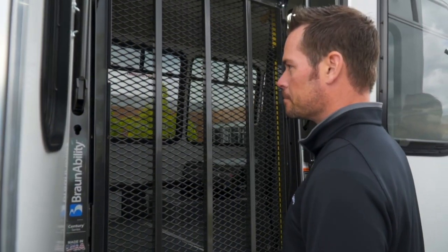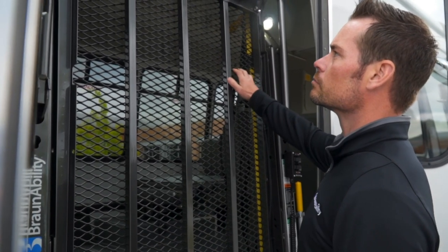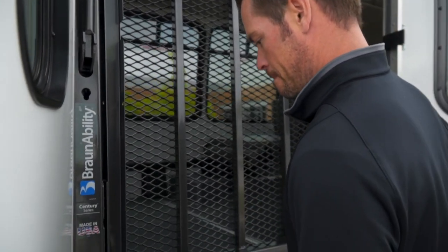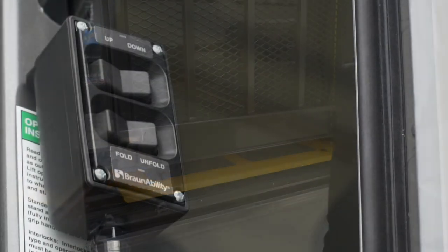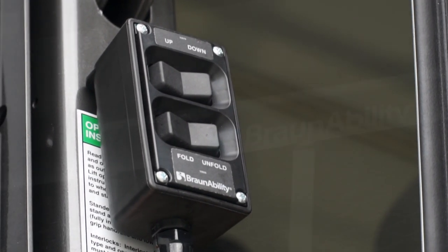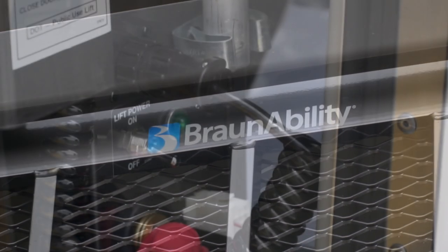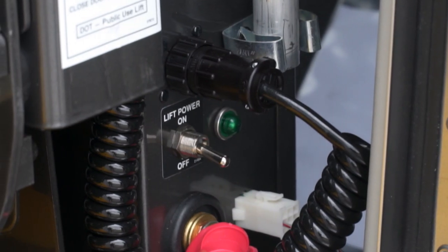Before attempting to use your lift, we also strongly suggest that you examine the unit carefully and notify the carrier immediately if you notice any damage that might have occurred in transit. If you notice damage, do not use your lift until any problems have been resolved or you have received confirmation from BraunAbility that your lift can safely be used.